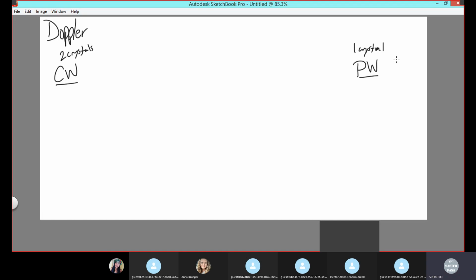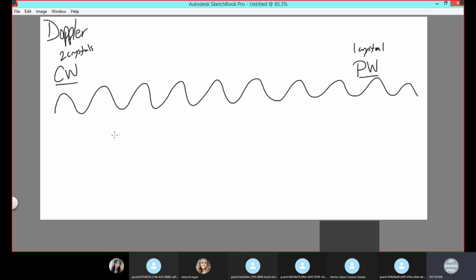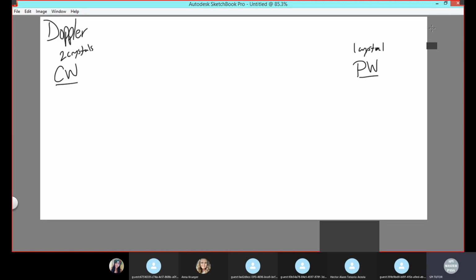So if you put your index finger and your middle finger over your carotid and you feel your pulse, there is a break. It's like boom, boom, boom. It's not brrr, right? There's a break in between. Okay, that's a pulse. Versus continuous, there is no break. That's why a continuous wave is like this. Continuous, doesn't stop. And a pulse is like this. Break, break, break. Okay, so they look different in every sense of the word. Now, when it comes to Doppler and damping material, they have some differences. So we'll cover both of them now.